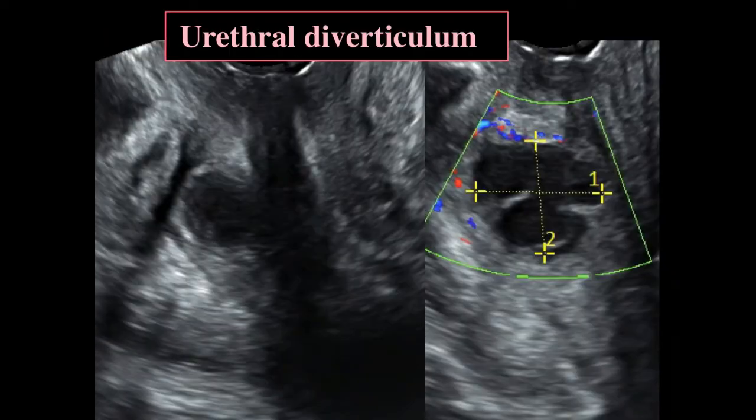Okay, now what else can happen in the anterior compartment where the urethra sits? You can have a urethral diverticulum. I'm sure many of the gynecologists among you have treated patients with that. It's not uncommon. And so here's the urethra. The view is always the same. Patient standing on her head. There's the bladder. Urethra is right here. We've blown it up. And there's an outpouching right here.